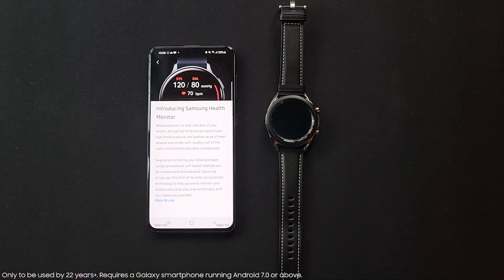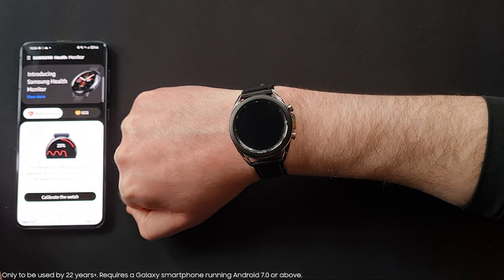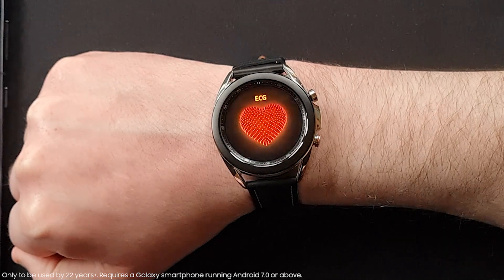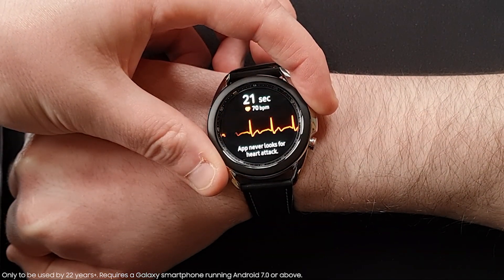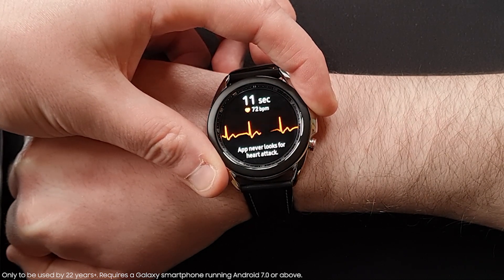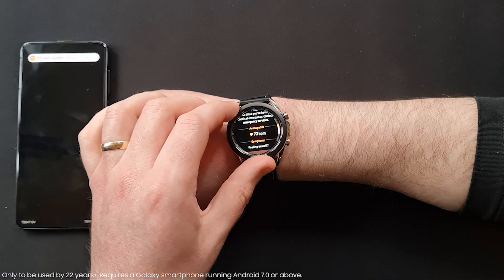But how do you use it? Pop your watch onto your wrist, make sure it fits snug, open the Samsung Health Monitor app on your phone and rest a finger on the watch's top button for 30 seconds. The app shows heart rate and rhythm classified as either sinus rhythm, a regular heartbeat, or AFib, an irregular heartbeat. You can then share the ECG data with your doctor.